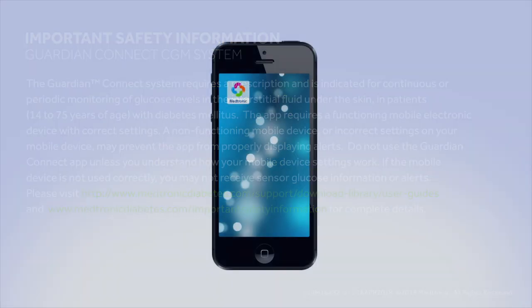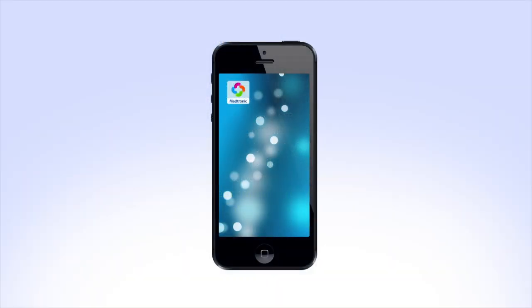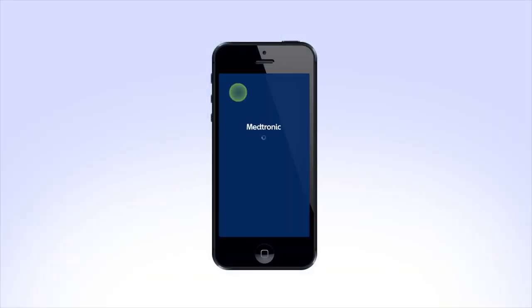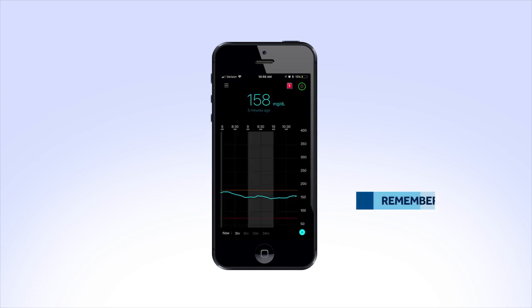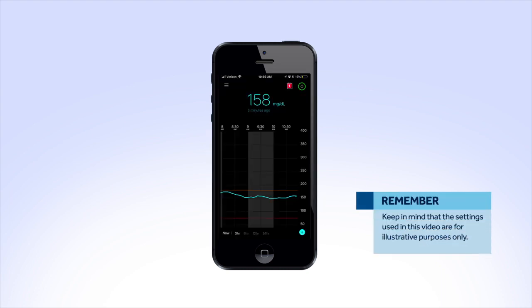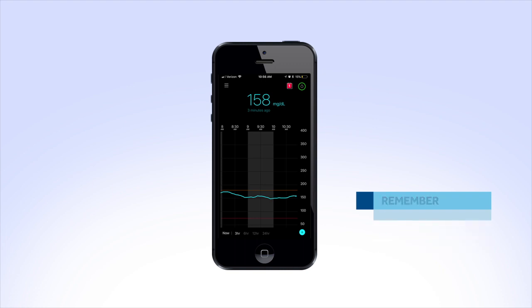In this video, we will show you how to set up different high and low alerts available on your Guardian Connect system and discuss other alert features. Keep in mind that the settings used in this video are for illustrative purposes only. Be sure to discuss with your health care provider what your settings should be.